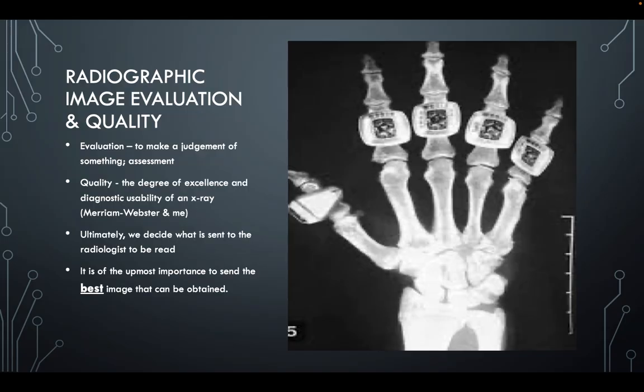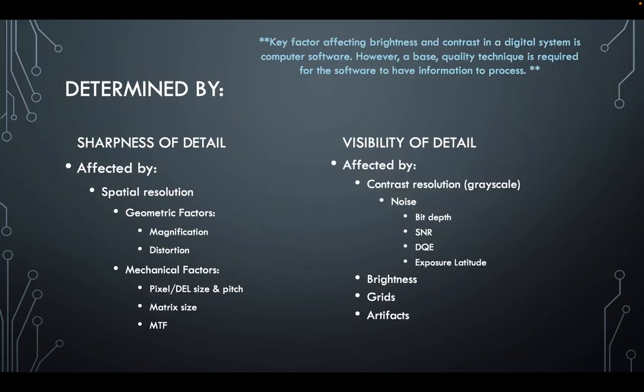Their blood supply is complicated, and so they're harder to heal. But my surgeon told me that missing that fracture could have ultimately led to pretty severe arthritis, if not a total ankle replacement. So these are the kind of repercussions that can happen from taking images that are not of diagnostic quality and sending them through to a radiologist. You're compromising patient care, so please make sure you're taking the time to build these habits and send through quality images.